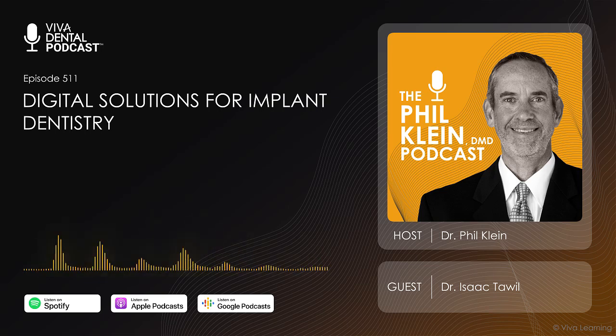Tell us about 3D printers. How have 3D printers been helpful to you as an implantologist, and how might 3D printing help general dentists in the area of implants? I think for any GP at this point, having a 3D printer can be very advantageous because we can print models whenever we want. We can print surgical guides. We can print bite splints, occlusal guards. We can even make teeth, and that's been the biggest advancement.